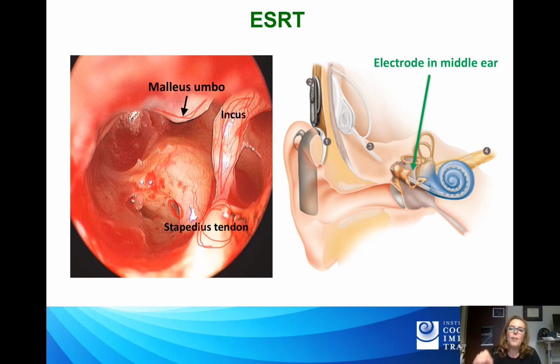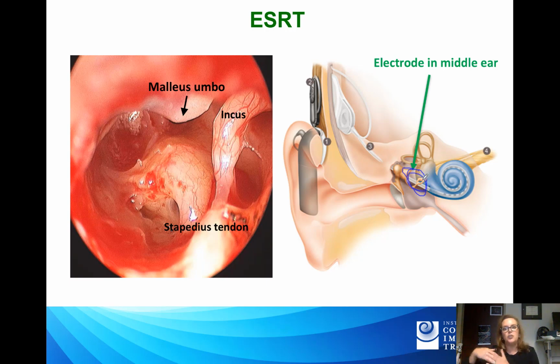So imagine if we need to place the probe in the implanted ear. Well, you can probably guess that there's going to be some changes to the stiffness of that system, especially if this electrode lead touches the bones of the middle ear system in any way. And it can happen. The surgeons do typically tie things down to try to keep it out of place, but the electrode lead is really coiled around, and there can be some movement of that lead in the middle ear system. And of course the ear's been operated on, so there are some changes inherently to the mechanics of that system.